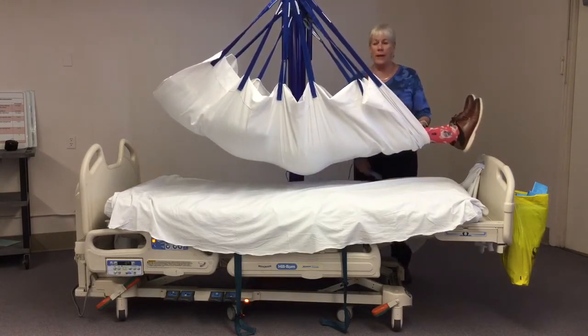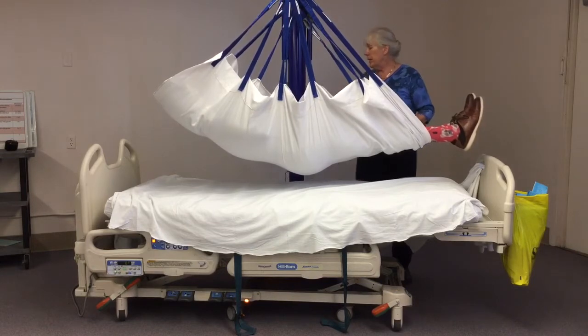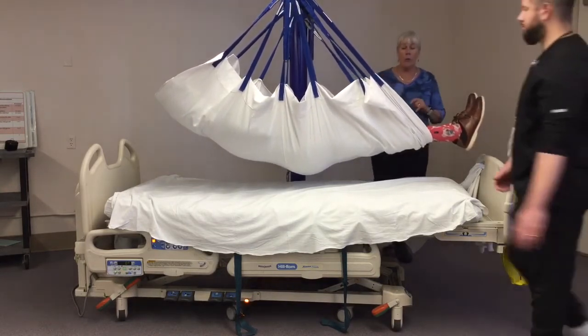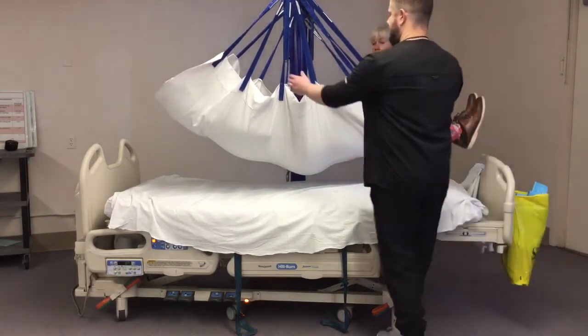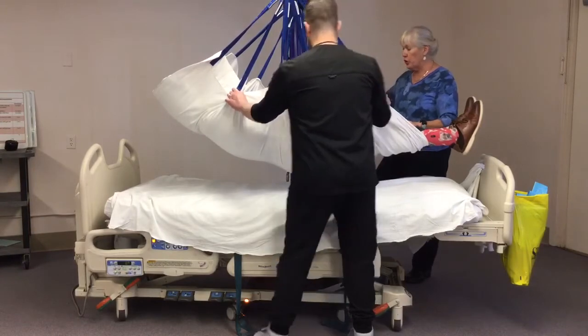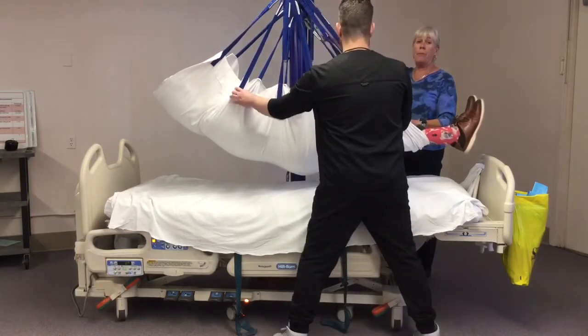We can change the bed, we can do whatever we need. If I need to move my patient up in bed, again, the brakes are unlocked and I have my partner help me. My partner is going to stabilize my patient and I'm going to push the machine. Let's say we're going up in bed.